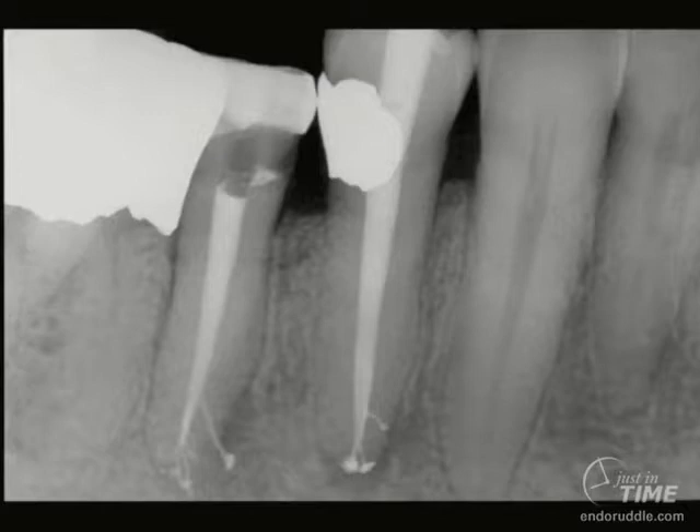Because if everybody has a complete access cavity with all the orifices identified, and if size 15 files are sitting at length at the terminus, virtually every dentist in the world can shape those canals and obturate them on a consistent basis.